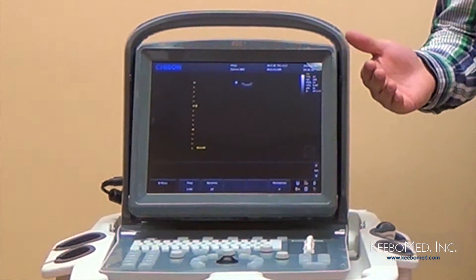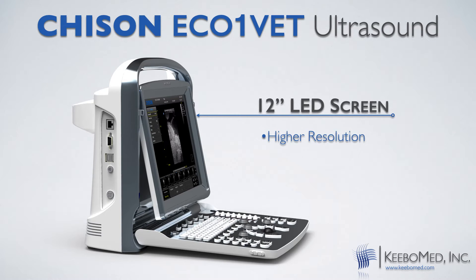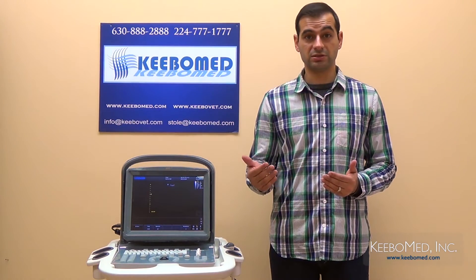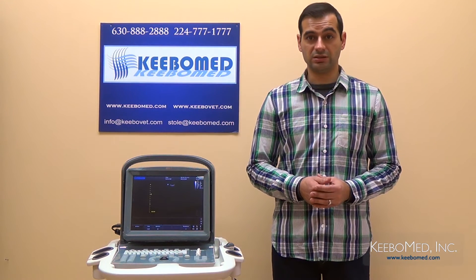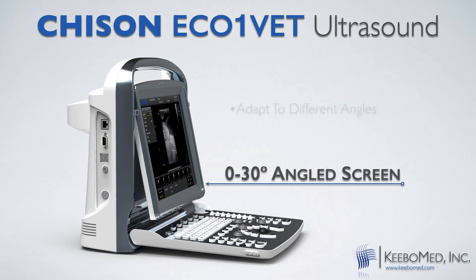You may wonder, what are the advantages of having an LED? Well, an LED screen will produce higher resolution images, which means images will have more clarity. Also, an LED screen is power saving, which is good for a longer battery life, and it is smaller in size, which will contribute to a lighter weight ultrasound. Another unique advantage of the screen is that rather than being fixed onto the machine, the angle can actually be adjusted from 0 to 30 degrees. This will ensure that the screen can be easily seen at any angle.